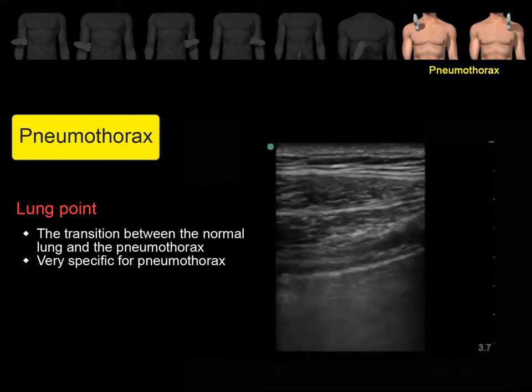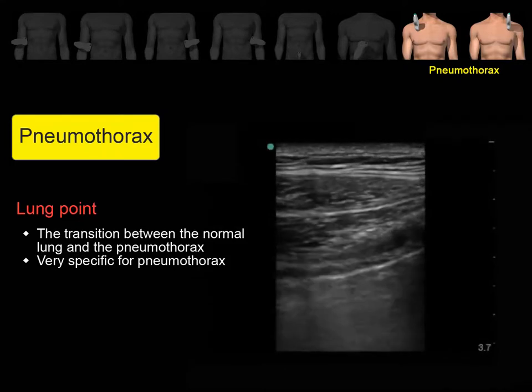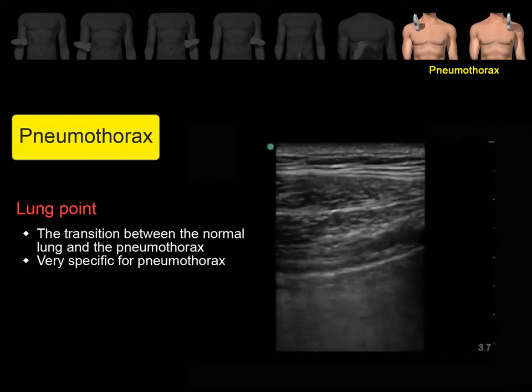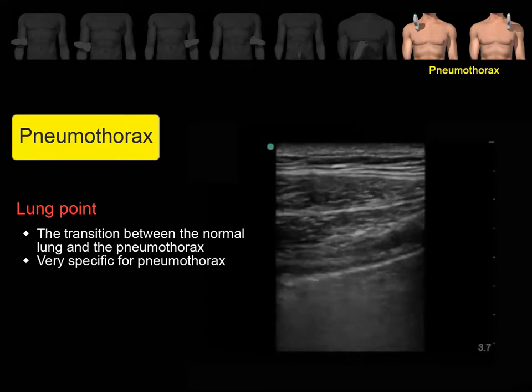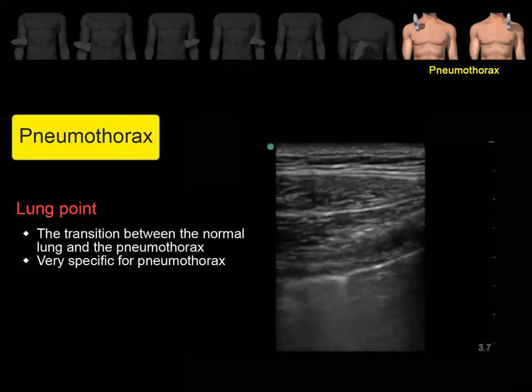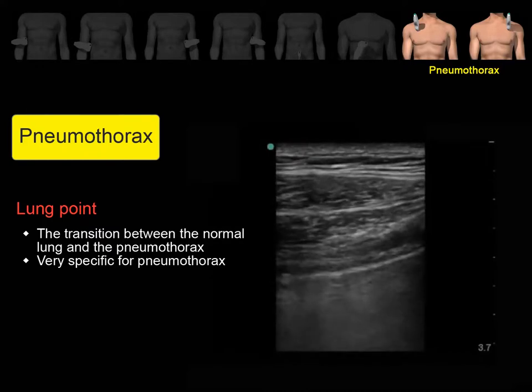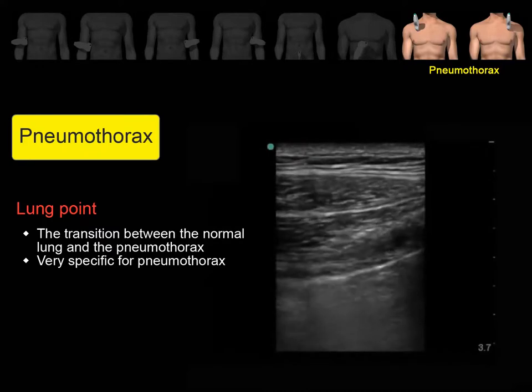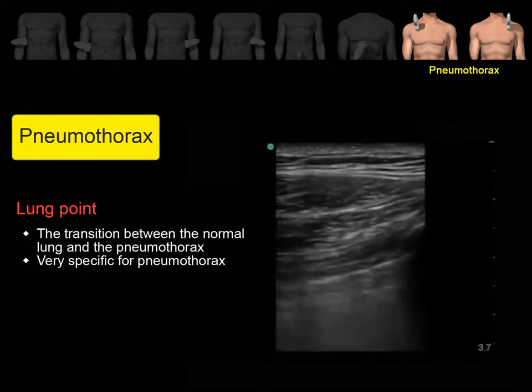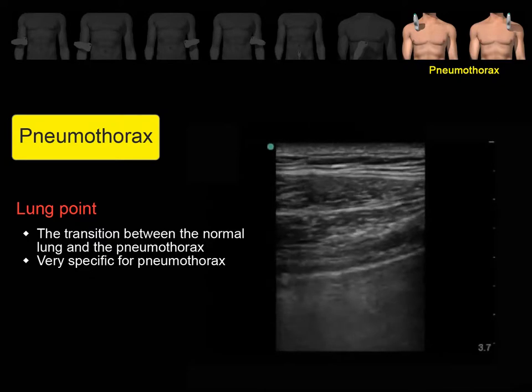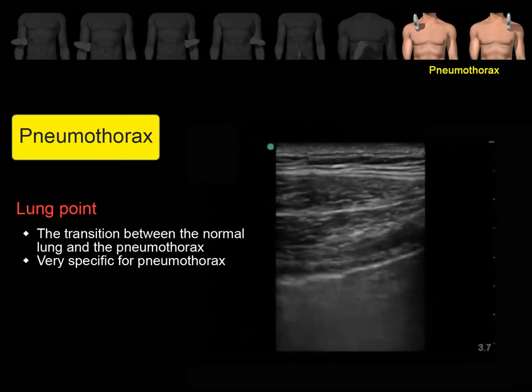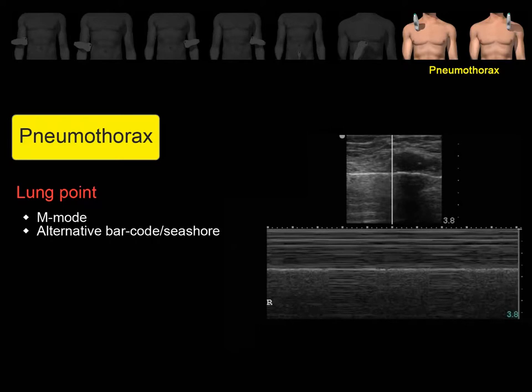Lung point. Lung point is the transition between the normal lung and the pneumothorax. Here you can see one area with sliding movement and one area without sliding movement — this sign is very specific for pneumothorax. If you run M-mode in this area, you will see alternating seashore and barcode patterns.